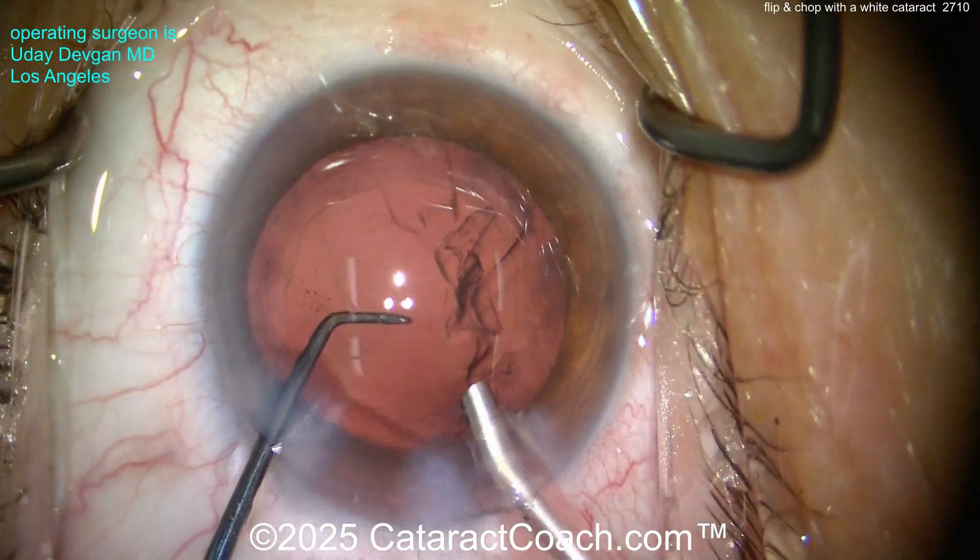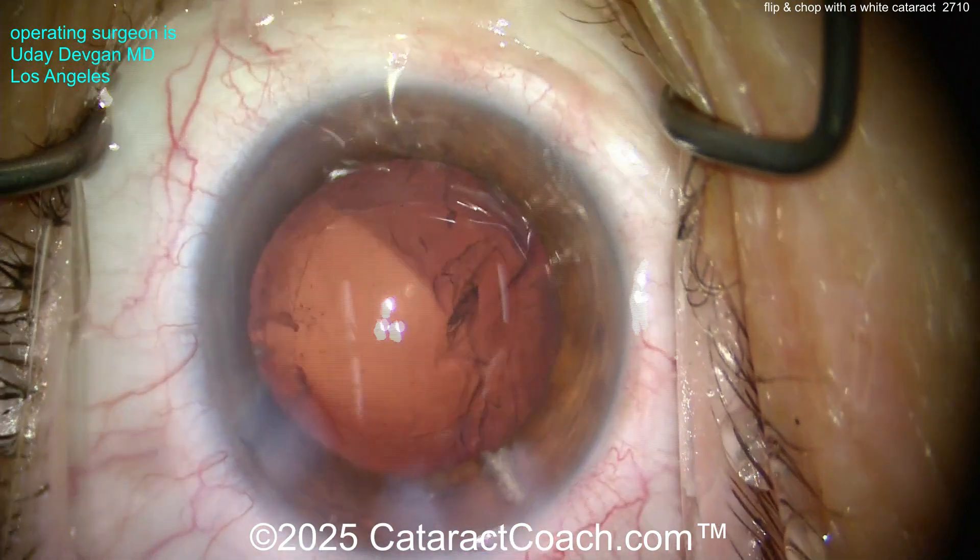Here's that last piece coming up — nice and easy. Get this last bit... that looks pretty darn good. That looks beautiful — come on out. Fantastic!